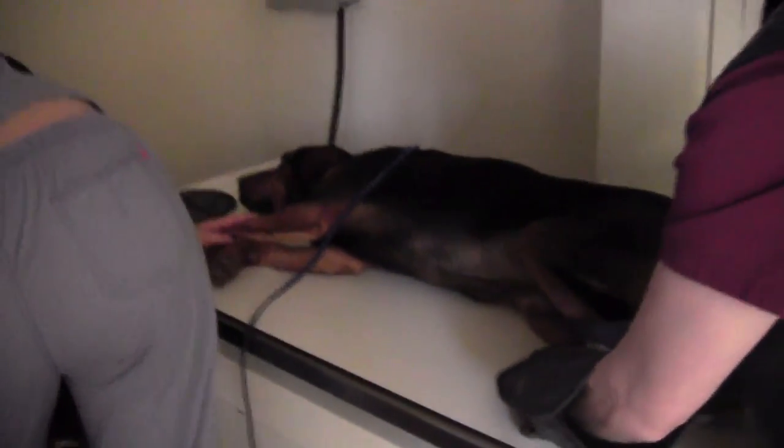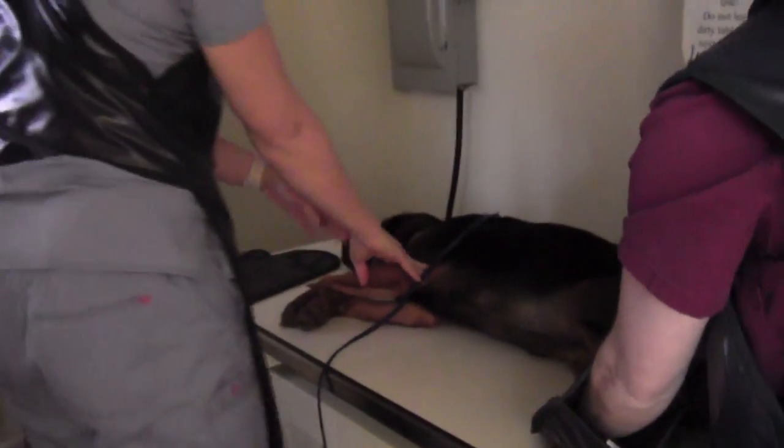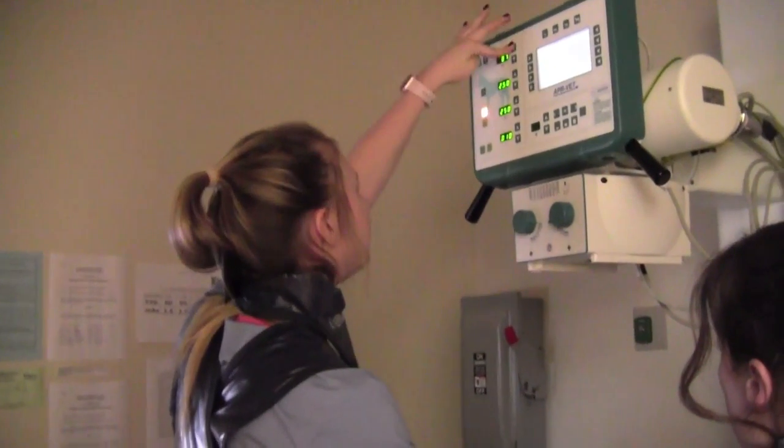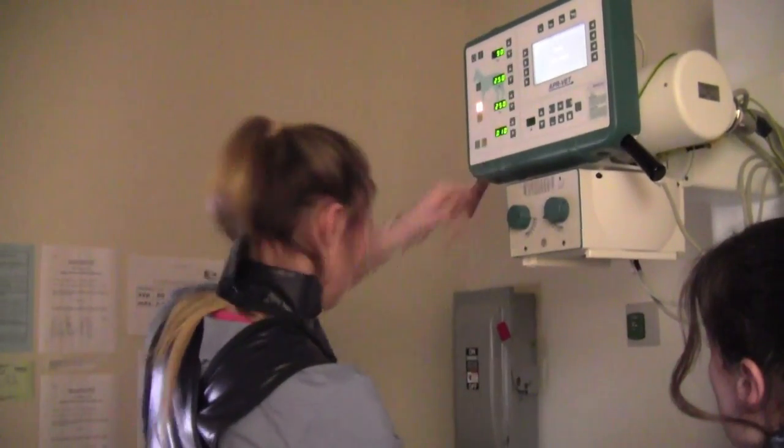If available, you could use sandbags to hold the forelimbs cranially and hold the hind limbs caudally, while keeping the head in a natural position with a sandbag possibly over the neck.